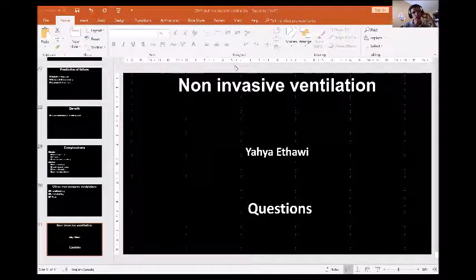In case of tracheostomy, an oxygen-dependent patient, how can I alternate ventilation and CPAP? When you use tracheostomy, it depends on the interface that you are using. So you can use CPAP, but you make sure that the interface gives the patient room to exhale. You can use a nasal prong.